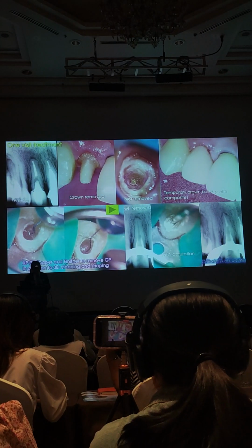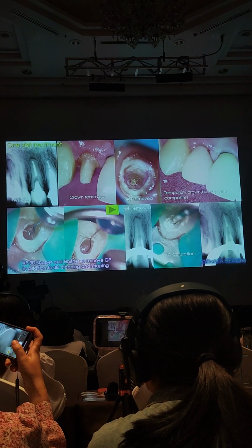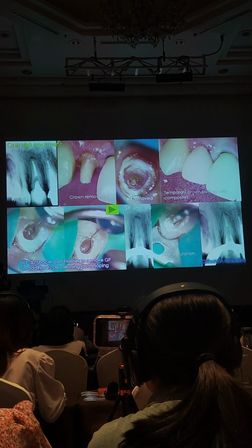So let me show you quickly. Here, this is pre-op. You see the lesion, the preoperative lesion. It's not big.